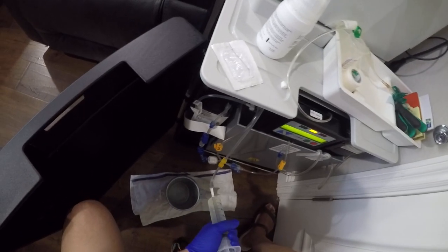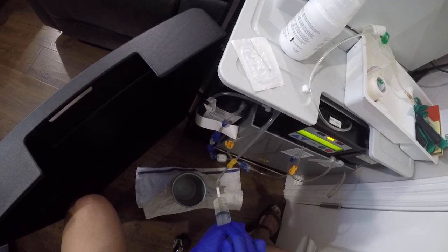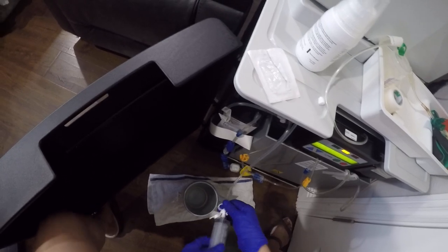This is similar to when you travel — you use the drain line that runs to the toilet manually.